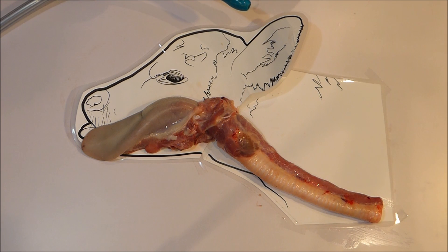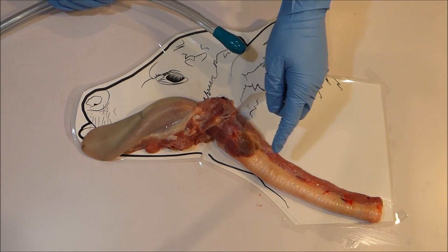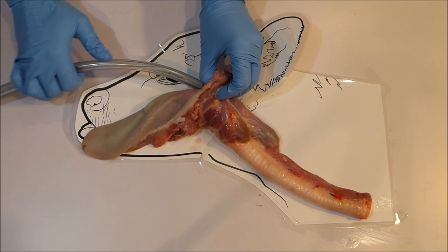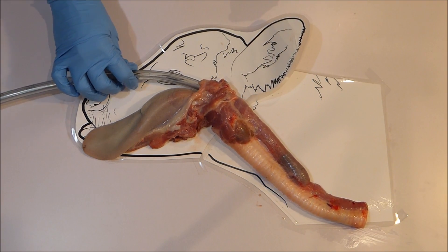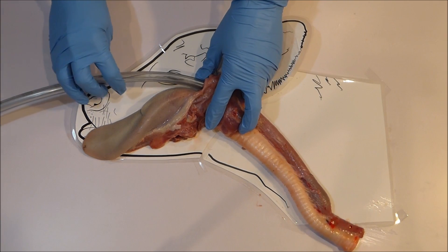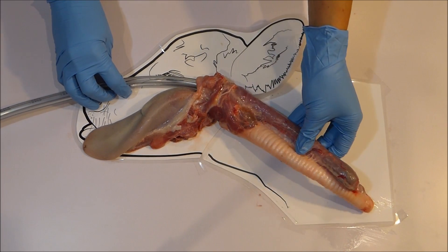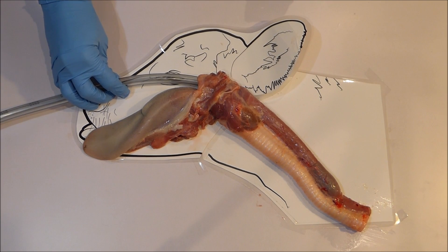Our next important point is to always ensure you pass the tube far enough. The tube needs to reach a safe distance past the airway entrance and stay there the entire time fluid is flowing, to ensure liquid does not access the airway entrance and end up on the lungs causing drowning. If you are concerned about not passing the tube far enough or accidentally pulling the tube out during feeding, simply pass the tube further down. Because this tube is flexible you will not do any damage, and passing the tube further is far, far better than not passing the tube far enough.